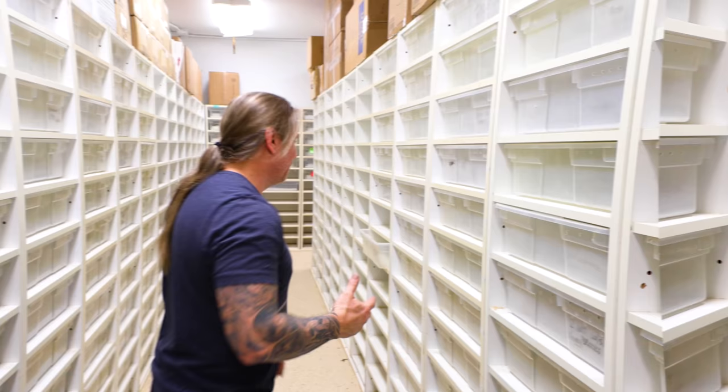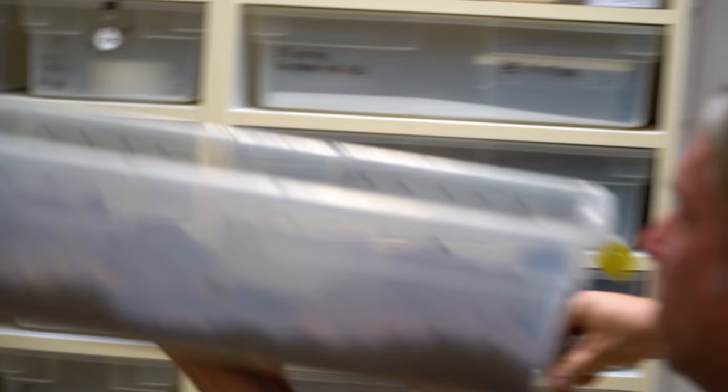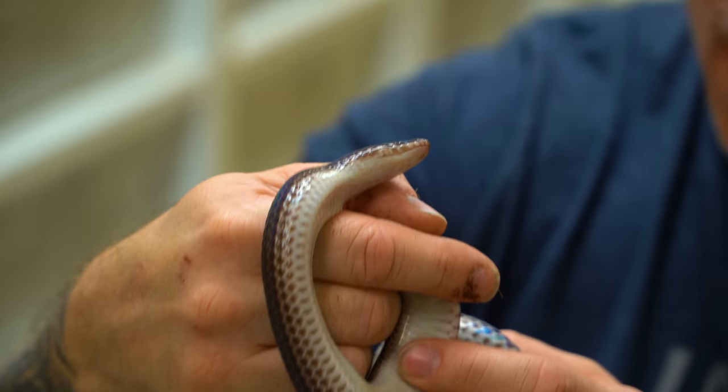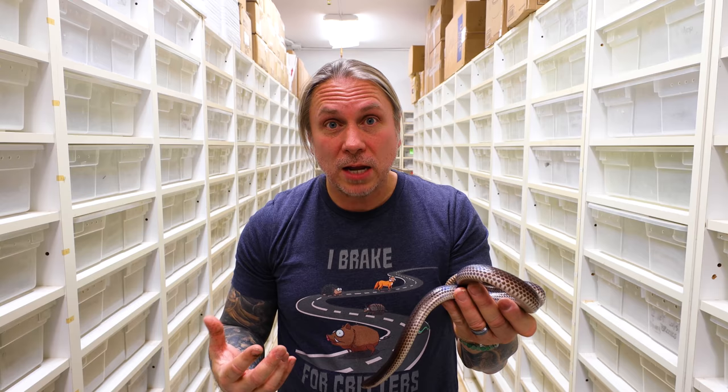It's going to be interesting because this one's mouth is really strange and it's a really wild snake. So here it is — a sunbeam snake. Absolutely incredible animals, one of the more interesting animals, but they have a nasty musk. My hands are already just full of the musk — it smells really garlicky and interesting. But you can see what I was talking about with that little flat mouth. It's going to be a little interesting to get the tube in, but we can absolutely do it. Still in very good body shape.